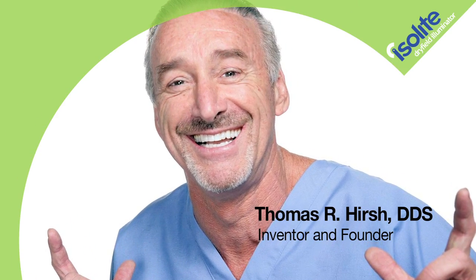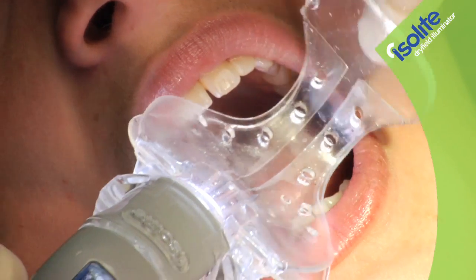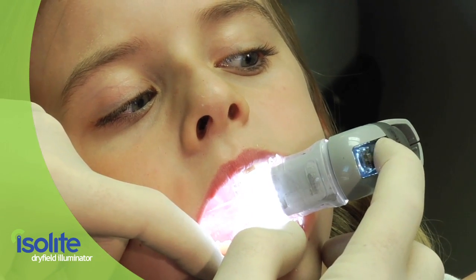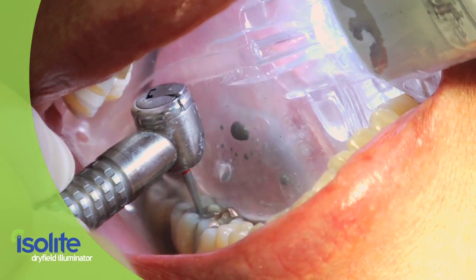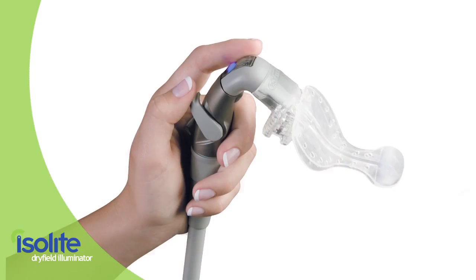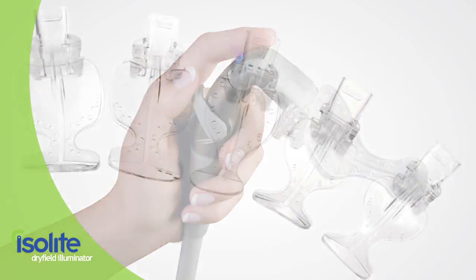These challenges led Dr. Thomas Hirsch to rethink dental isolation and invent the Isolite Dry Field Illuminator — a technology breakthrough that delivers illumination, hands-free evacuation, and retraction all in one easy-to-use device.